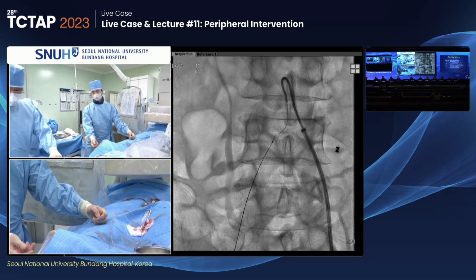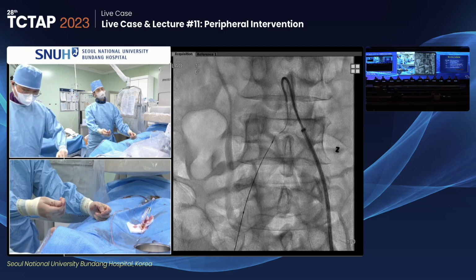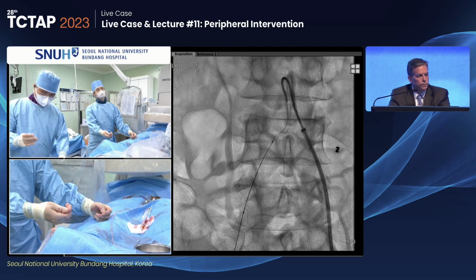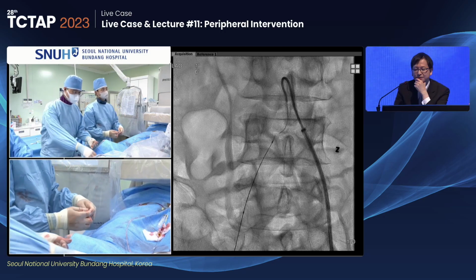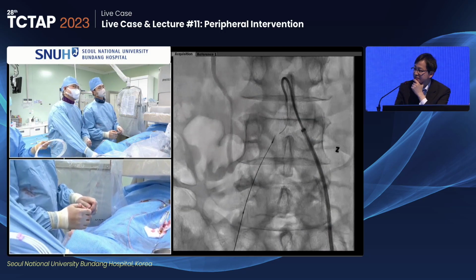What about IVUS? They do that in Japan quite a bit to follow their path for the rendezvous. Sensei? Yes, thank you. I think IVUS is a good candidate to assess the wire location.